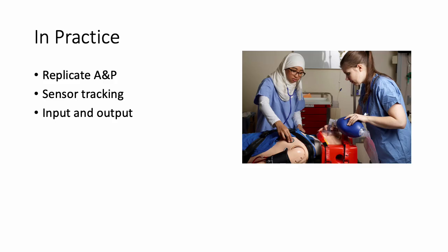They also can recognize inputs and outputs. They can detect if the learner inserts a needle for a needle chest decompression or starts chest compressions for CPR. The outputs are based on the learner's performance, as the simulator can have increased or decreased bleeding based on what the learner is doing on the simulator. Their job is to respond to procedures and exhibit signs and symptoms that require intervention.